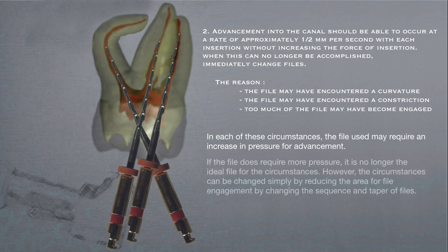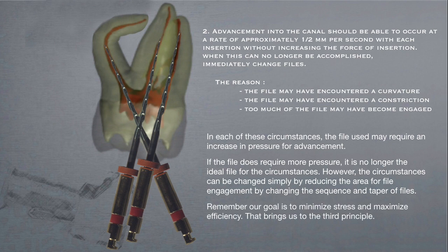If the file does require more pressure, it is no longer the ideal file for the circumstances. However, the circumstances can be changed simply by reducing the area for file engagement by changing the sequence and taper of files. Remember, our goal is to minimize stress and maximize efficiency.